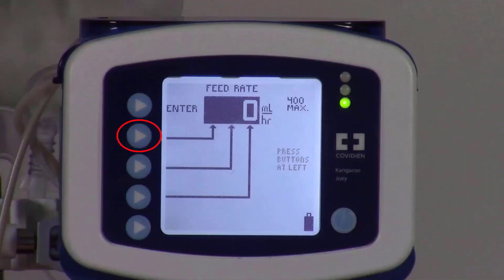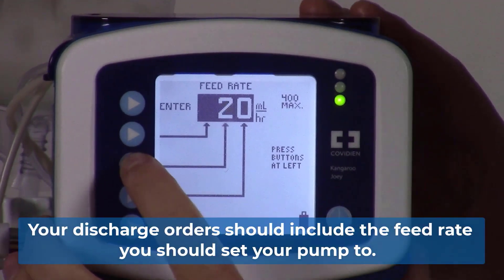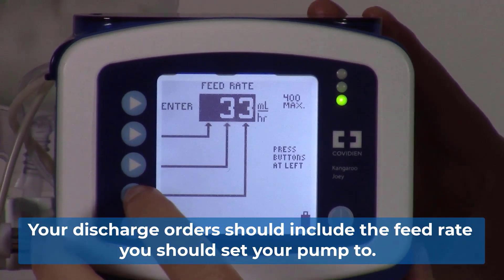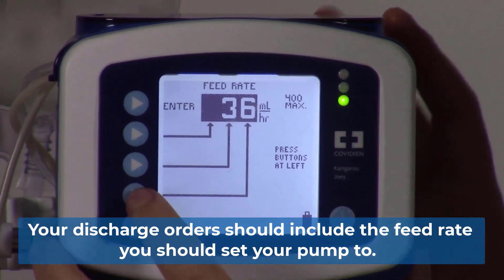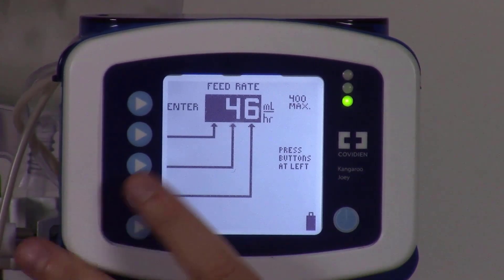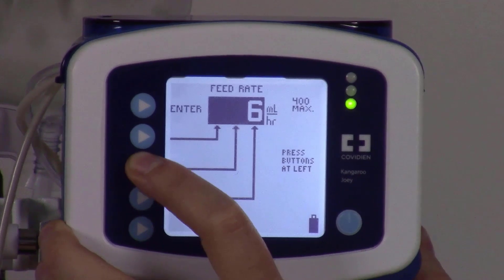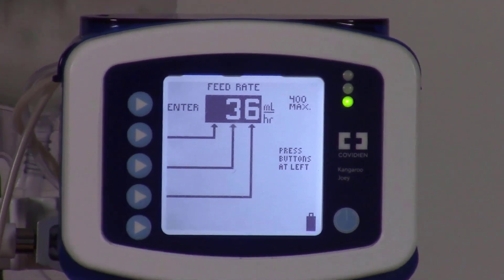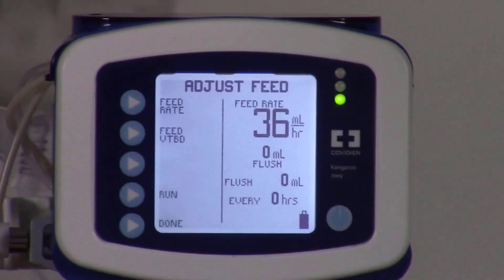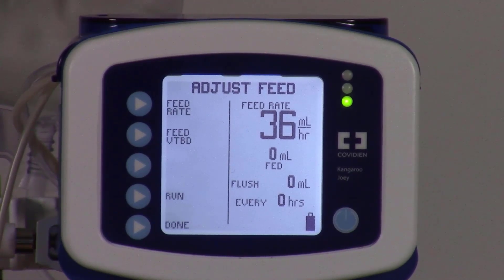The buttons on the left correspond with the hundreds place, the tens place, and the ones place. Set it to 36 mL/hr. If you were to make an error with programming and say set it to 46, you can continue pressing that button until it goes up to 9 and then resets back down to 0. 36 is our desired rate — select enter. The screen confirms the feed rate is set to 36 mL/hr, exactly correct as determined by our discharge orders.